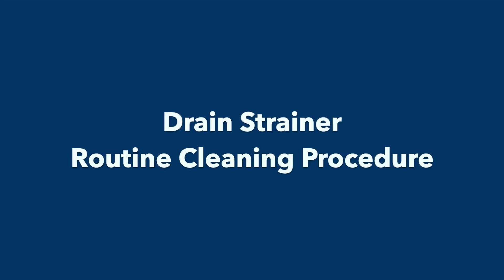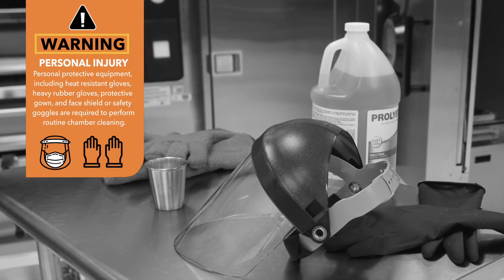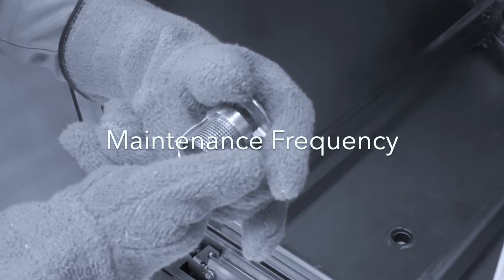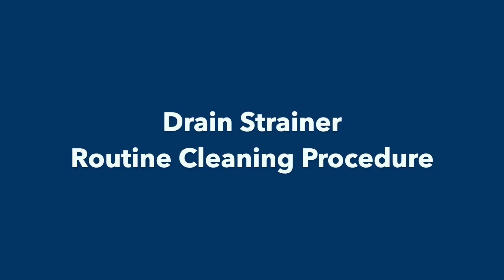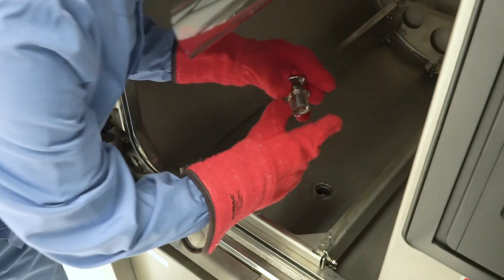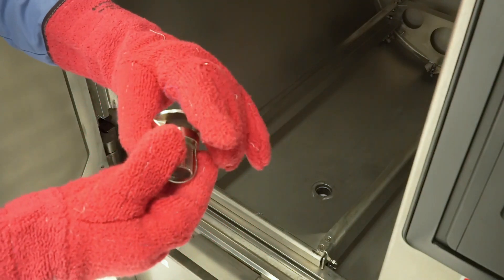Drain Strainer Routine Cleaning Procedure. The Chamber Drain Strainer should be cleaned at least once a day, preferably in the morning before running the first cycle and whenever the strainer is clogged with debris. Review the Operator Manual for more information about how to properly remove and clean the drain strainer. Daily Drain Strainer Cleaning Procedure, Step 1: Wear heat-protective gloves prior to cleaning the chamber drain strainer, unless the sterilizer is cool. Step 2: Remove the strainer following instructions provided in the Operator Manual.